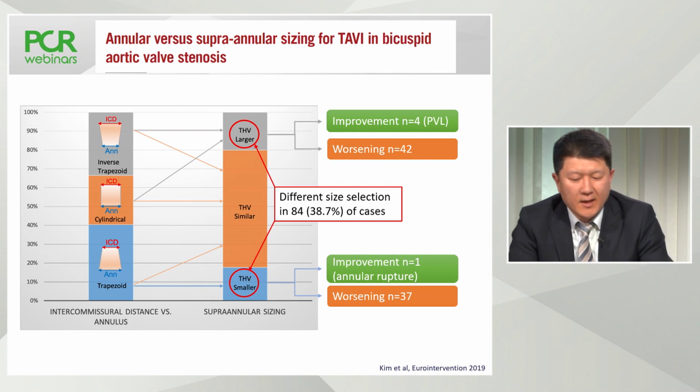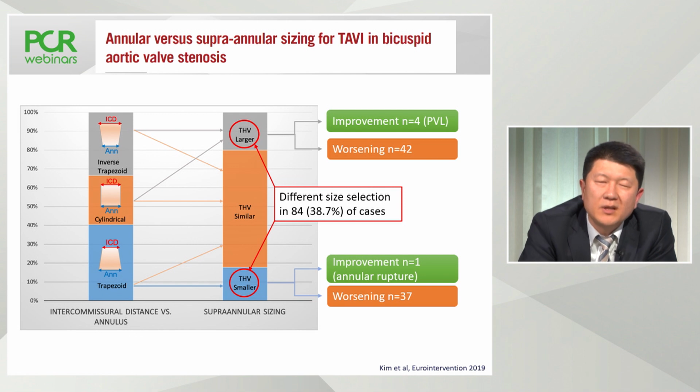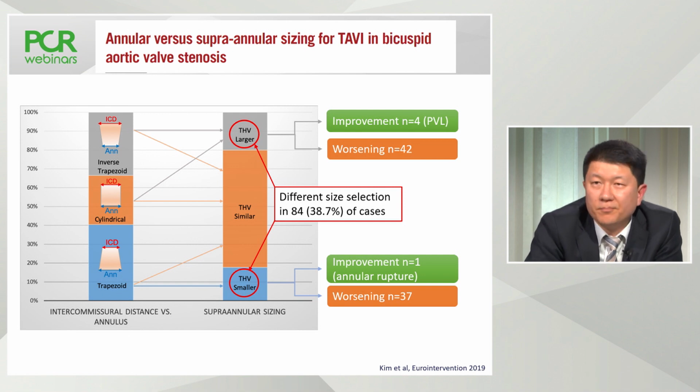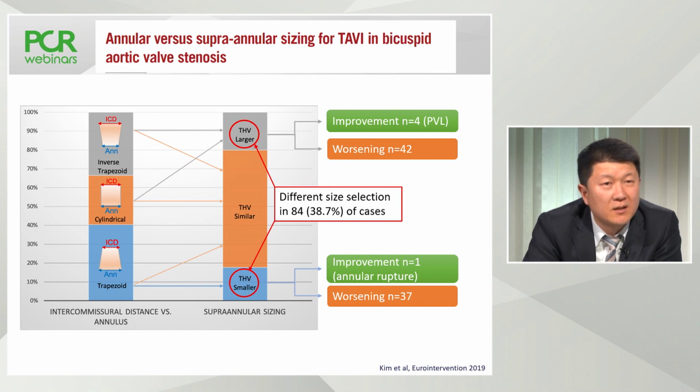And Didier Tchetche has put it in a similar way, actually. He is recommending annular sizing in the majority of patients. In some few patients, it might be advisable to take into account supra-annular measurements, especially if you have borderline situations.